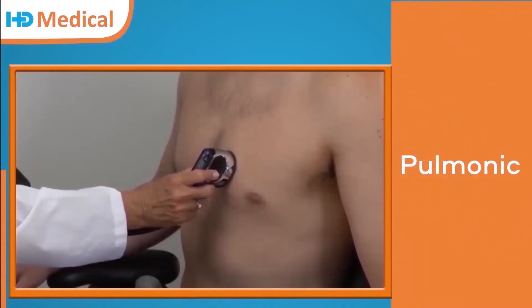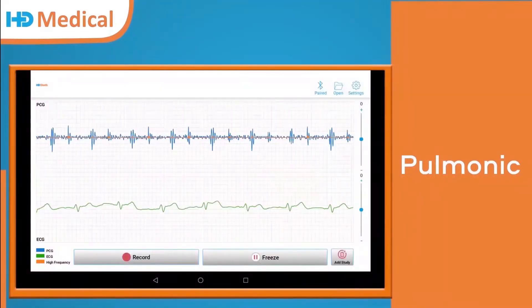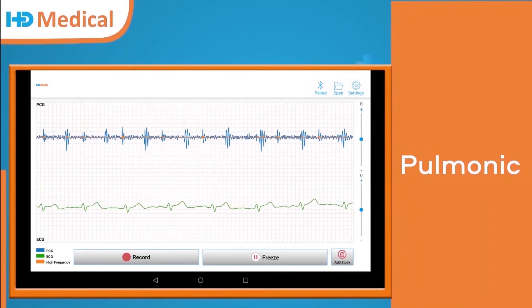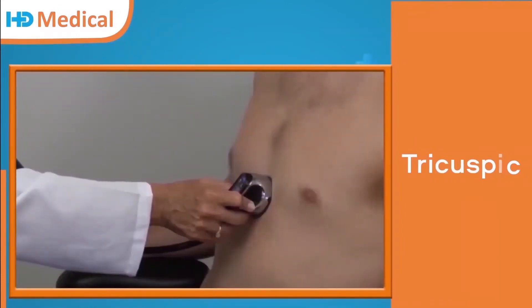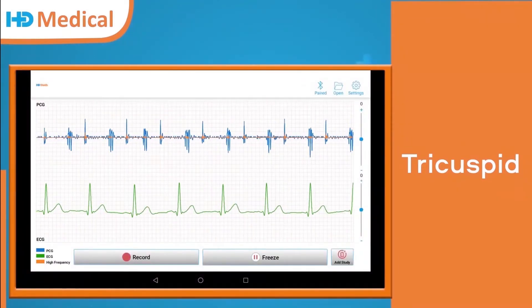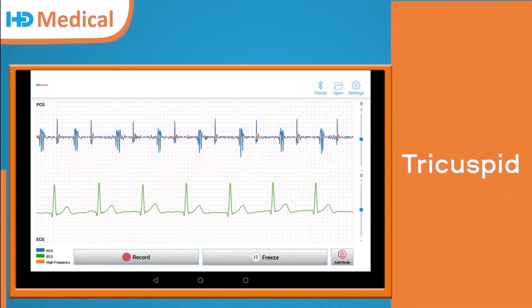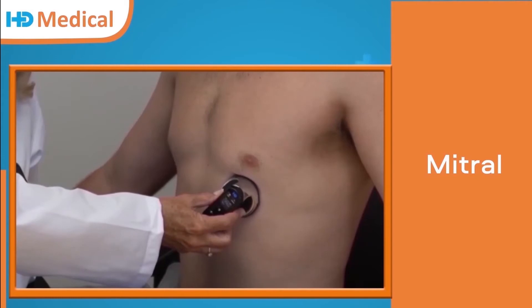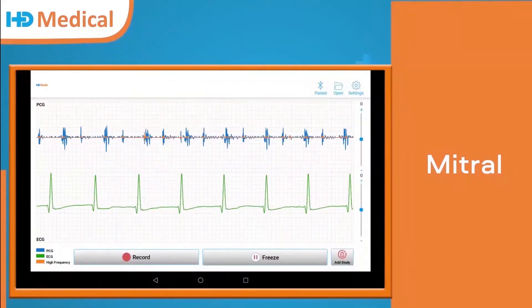Now we are measuring for the pulmonic position. This is the pulmonic waveform. The third position is the tricuspid. Tricuspid waveform. This is the mitral position. Mitral waveform.